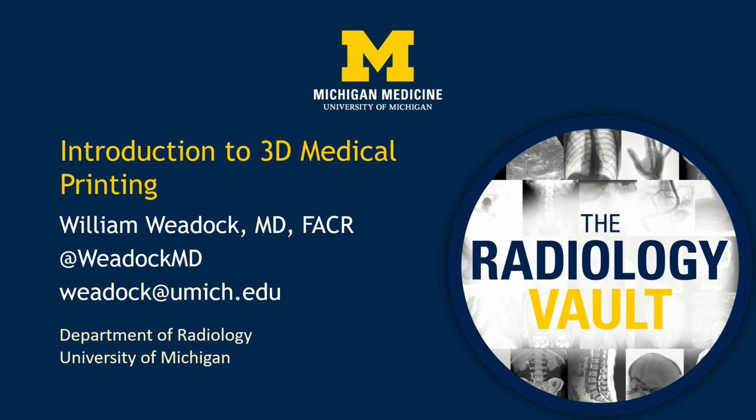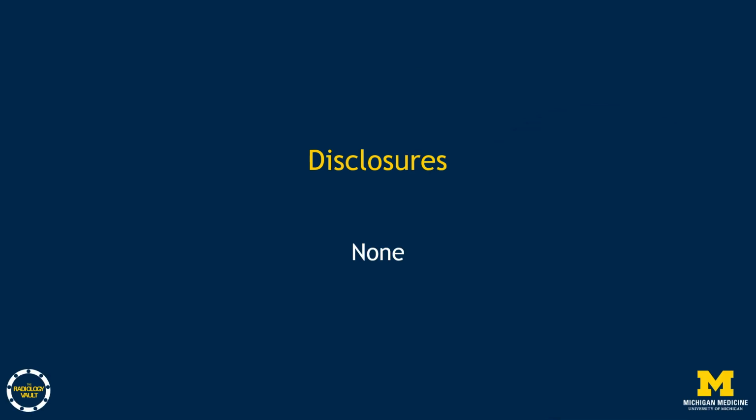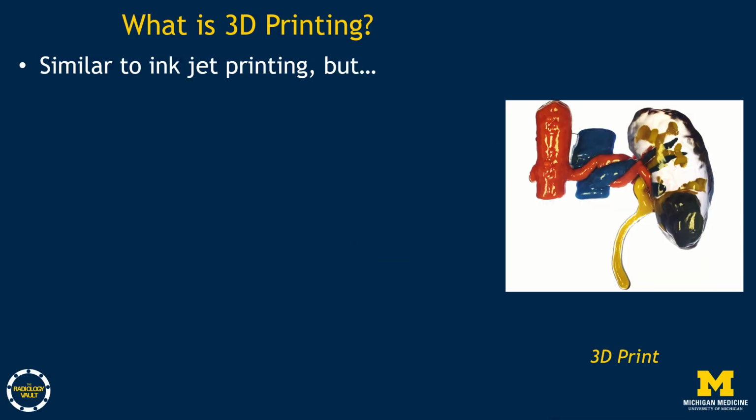Welcome to the University of Michigan Department of Radiology Vault, a collection of short radiology lectures. My name is William Weadock, and I'm one of the abdominal radiologists at the University of Michigan. Today I'm going to be talking about an introduction to 3D medical printing. I have no disclosures. What is 3D medical printing?